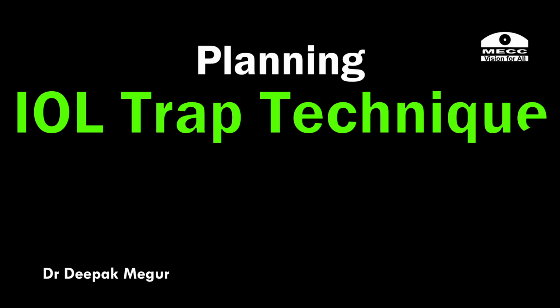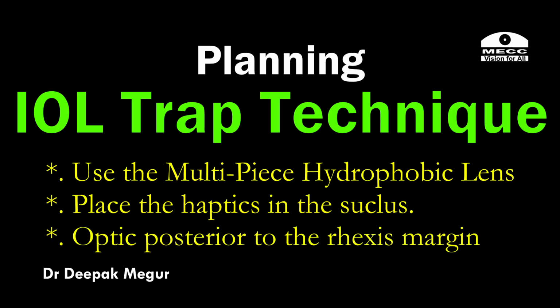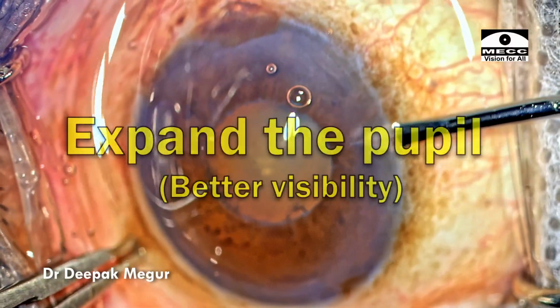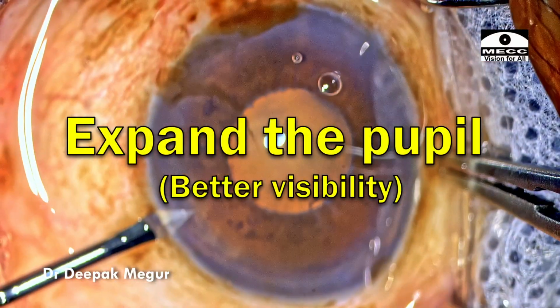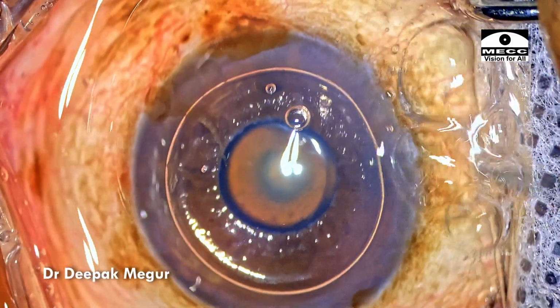So in this case, I'm going to demonstrate the IOL trap technique, wherein I'm going to use a multi-piece hydrophobic lens and place the haptics in the sulcus and the optic posterior to the rhexis margin. The first goal always is to take care of the pupil so that we expand the pupil, then we can manage other complexities as and when they come.